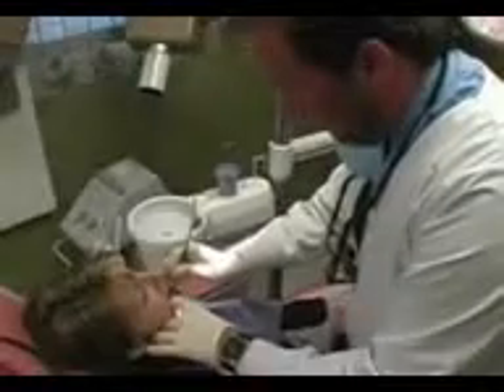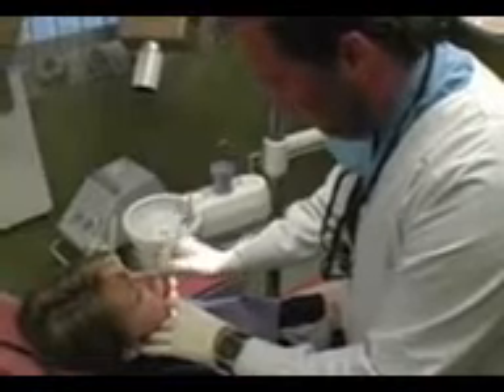I'm here with Sheila and she has a sensitive tooth, so I'm going to do some tests. I'm going to tap on the tooth to see if it's sensitive — and it is. Then I'm going to try some cold stimulus called endo ice. We put a little endo ice on the tooth, and since it is sensitive, we're going to go ahead and start a root canal.